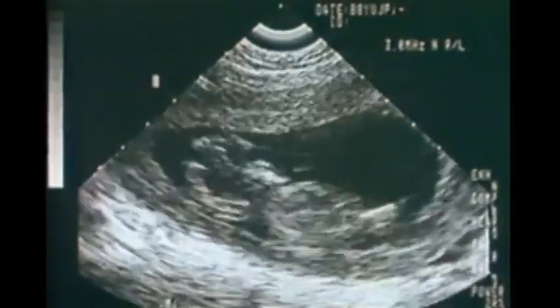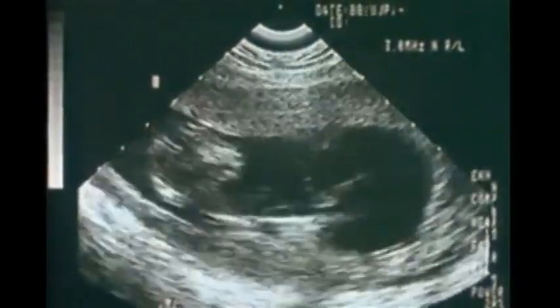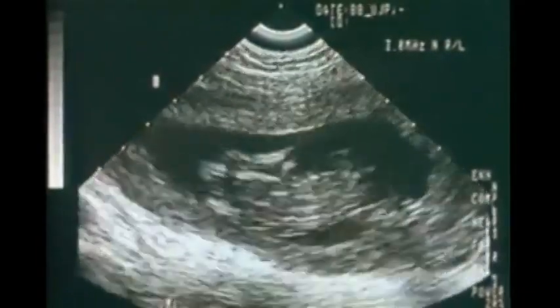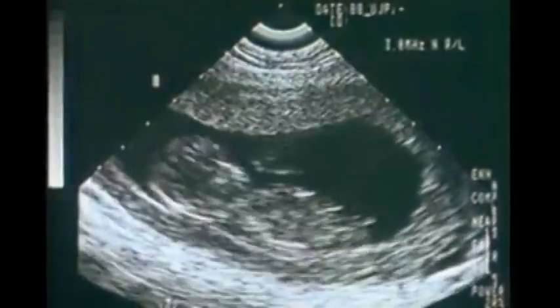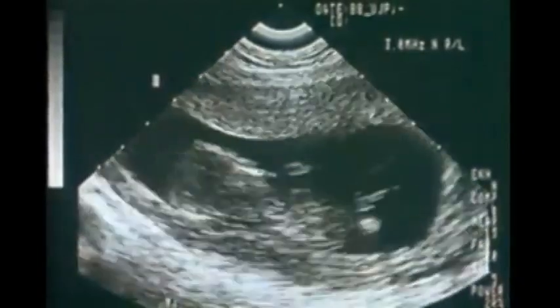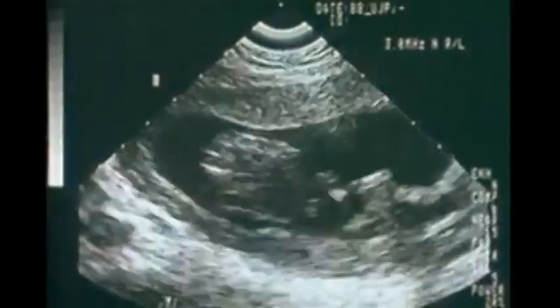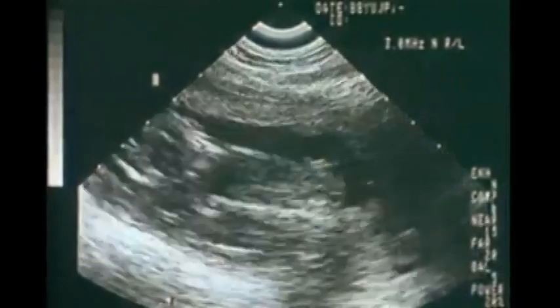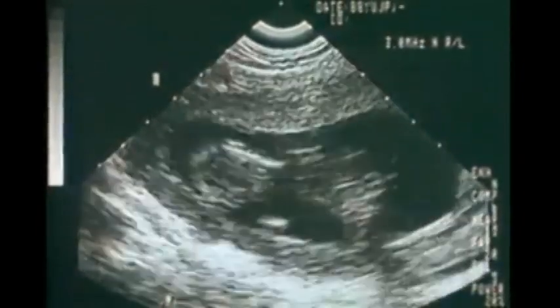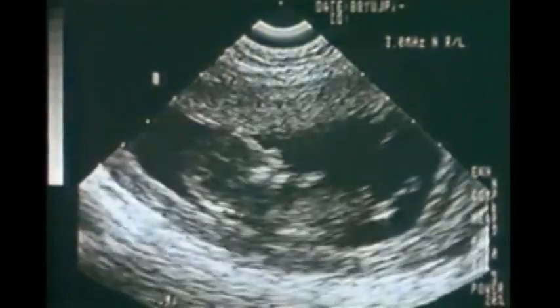Now, the heart rate has speeded up dramatically, and the child's movements are violent at this point. It does sense aggression in its sanctuary. It is moving away. One can see it moving to the left side of the uterus in an attempt, a pathetic attempt, to escape the inexorable instruments which the abortionist is using to extinguish its life.